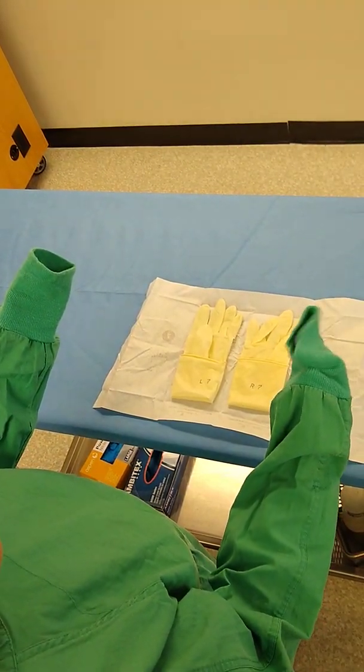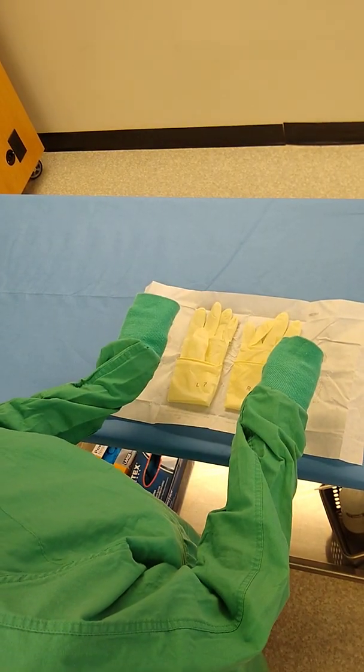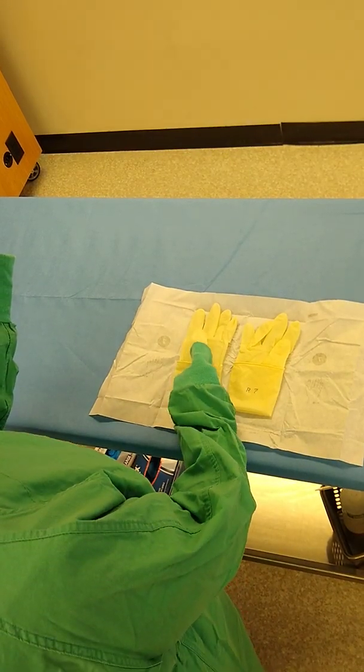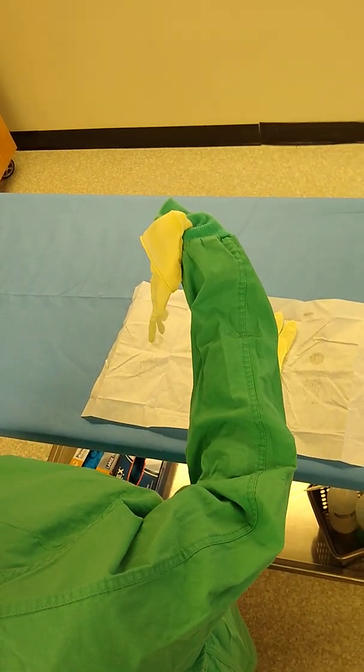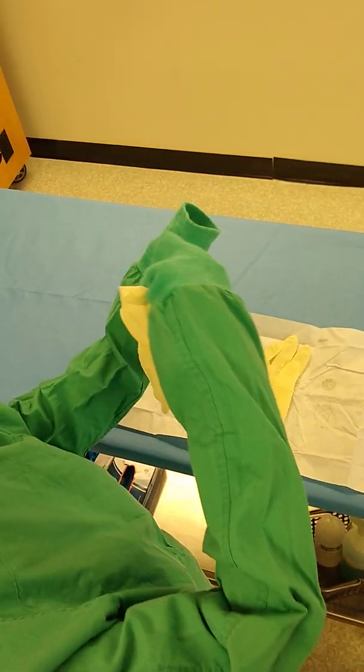The entire glove is technically sterile at this point, so you can go ahead and pick up this part, the very base of it. You're going to lay the glove on top of your hand.